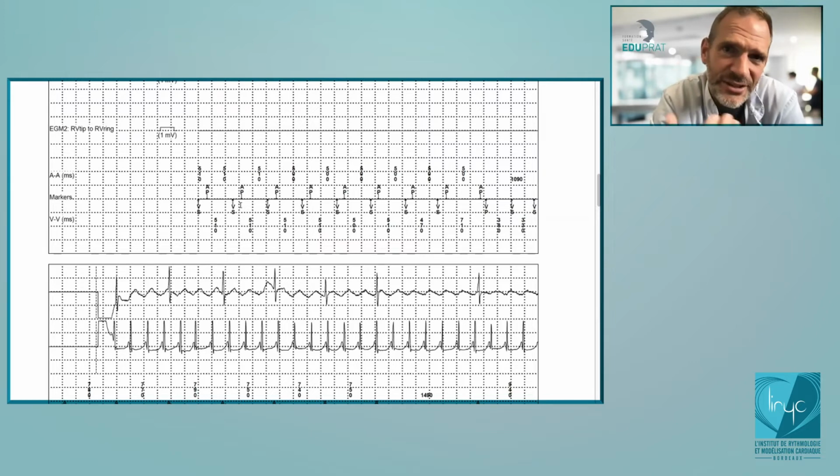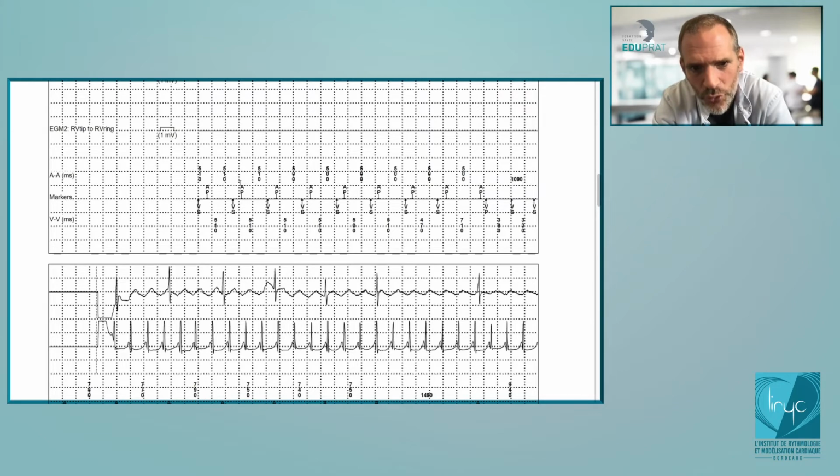And some physicians said, okay, I'm not very happy with this algorithm because of this problem. It means that with the old version, there is no switch for long PR interval. Whatever the PR interval, even if it is very long, if there is one VS in between each atrial pacing or atrial sensing, then it will not switch to DDD, okay?